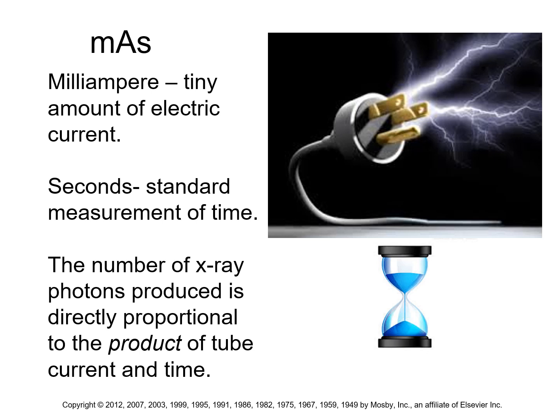All right. mAs. mAs is a component of electricity. It stands for milliampere, milliampere or milliamperage. Okay, it's a measurement of current. Now, what the heck is current? Well, current is the amount of electricity flowing in your circuit. It's literally how many electrons are rocketing past at this point, rocketing from the plug to the wall and back. Okay, that's what amperage is.